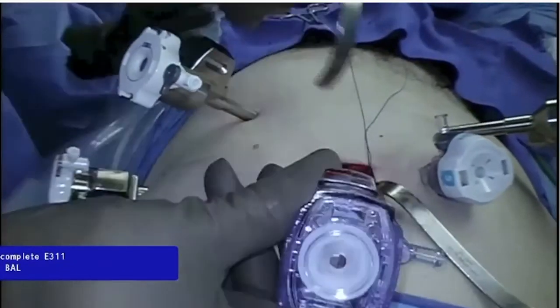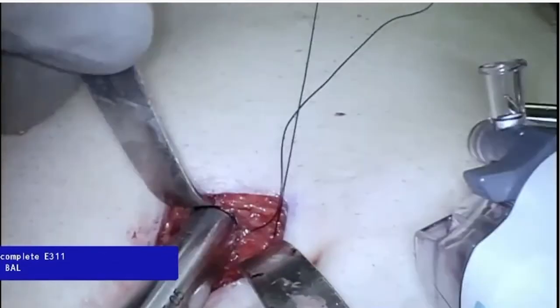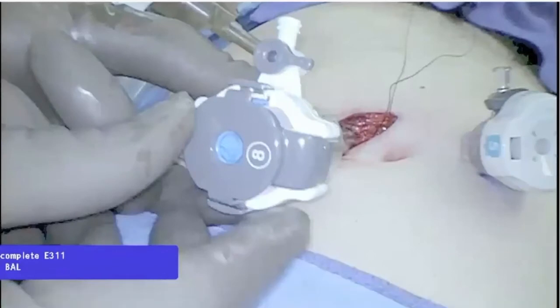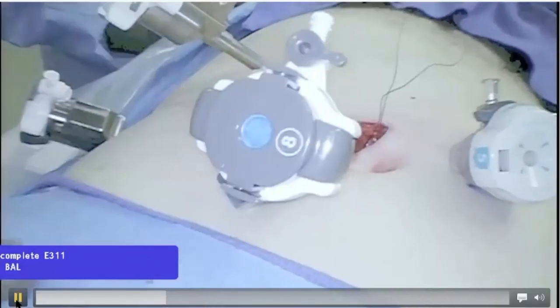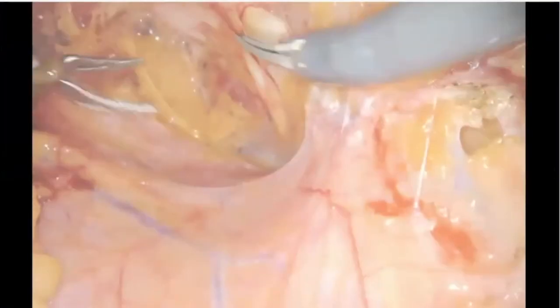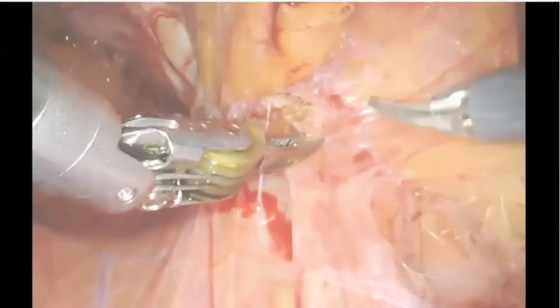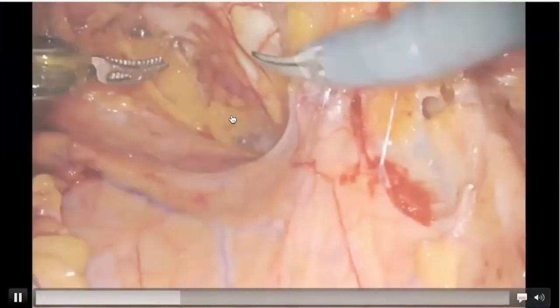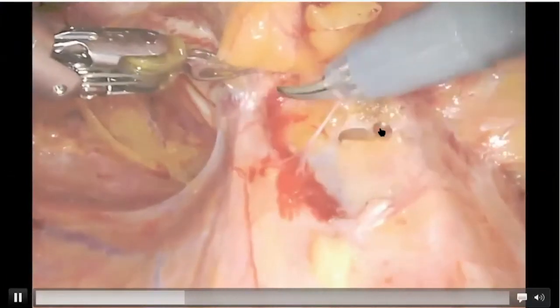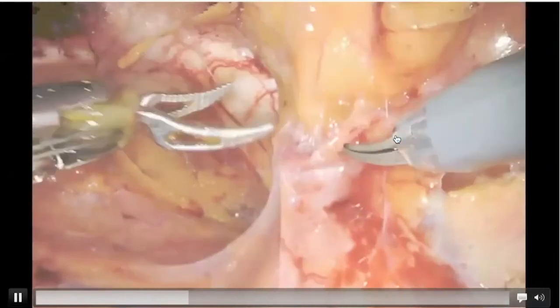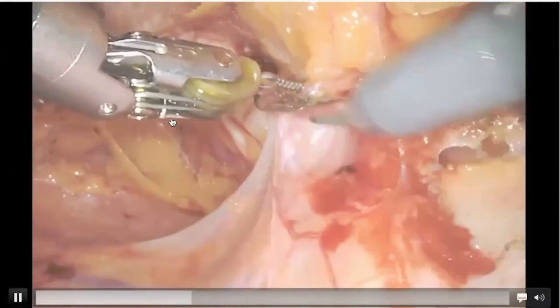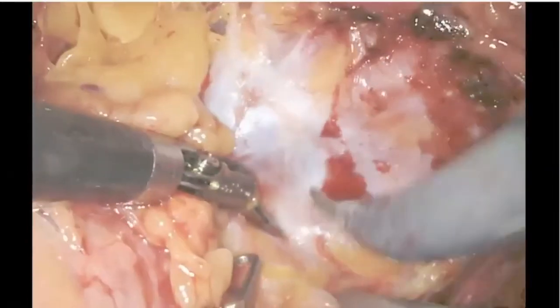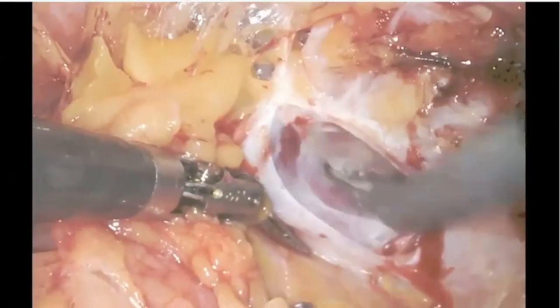At the end I have to exchange this trocar for a 12-millimeter stapler trocar — that's the issue with the XI. This is exchanging to the 8 millimeter to allow you to get the proper camera in place. In this patient who had a hernia repair, I was dissecting laterally to allow the assistant from the right side to come over the mesh because it was making things difficult. Despite a peritonectomy, the procedure was uneventful. You can access the pelvis without difficulty.